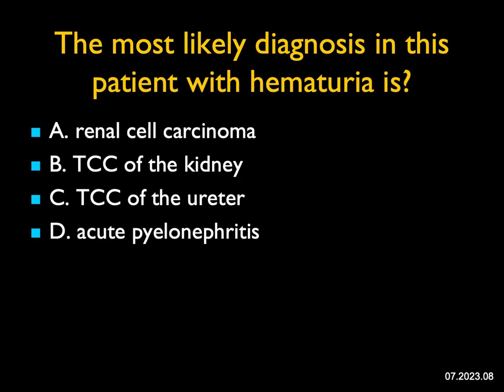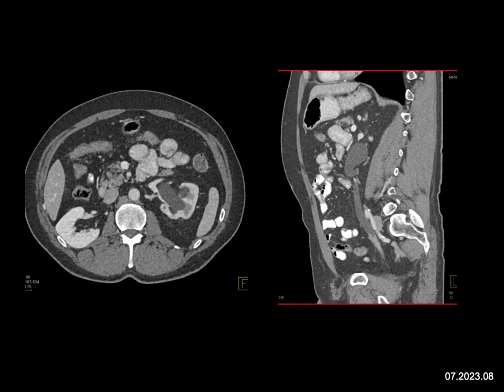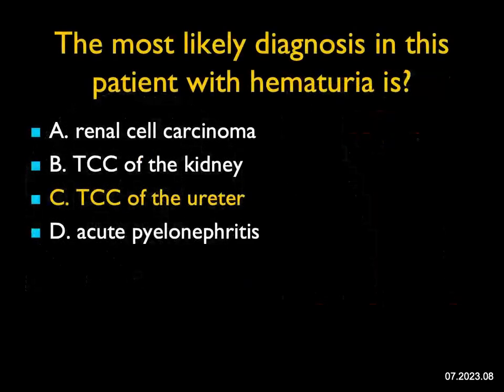The most likely diagnosis in this patient with hematuria — the right kidney looks pretty good, but the left kidney is obstructed. When you look carefully, you see a dilated ureter on the sagittal view, and very distally in the ureter there's soft tissue. That's not a stone — that's going to be an infiltrating process, a transitional cell carcinoma. So this is not a renal mass; it's a ureteral mass — a very nice example of a TCC of the ureter.